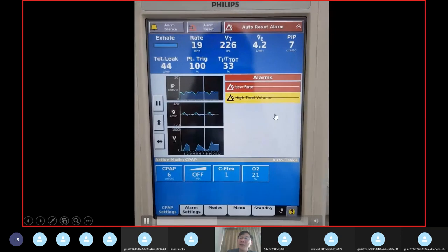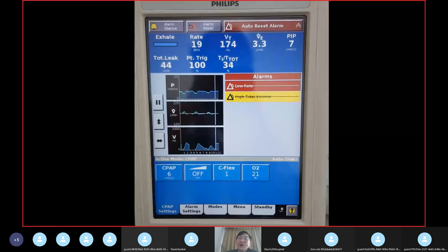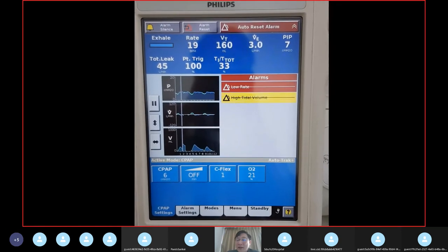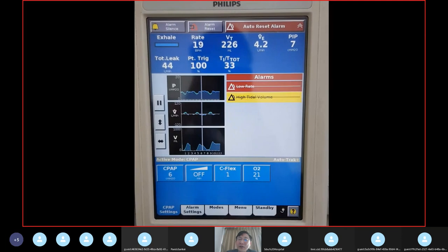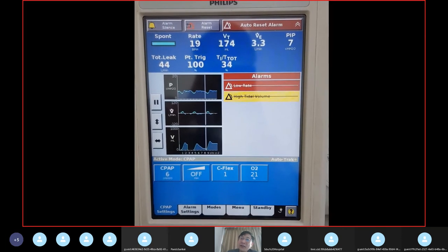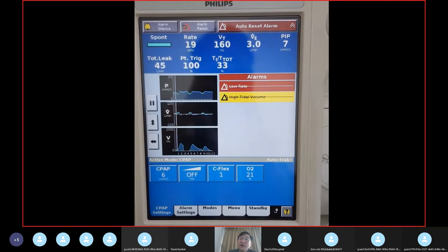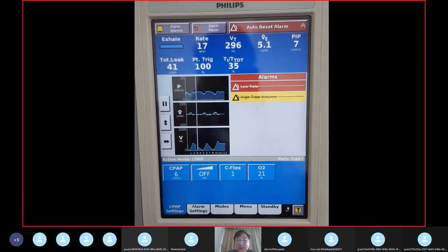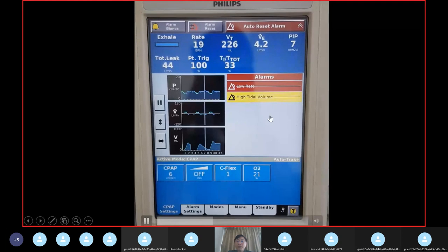It will tell you, because sometimes we were too excited, too kanjong. We forgot to put in the oxygen, or sometimes the oxygen connection might be loose. You didn't notice that it might not be plugged in properly, and you try to put NIV on the patient thinking you are giving 100% oxygen, but in fact you are not delivering 100% oxygen. So that's a very important thing that you always have to look into.